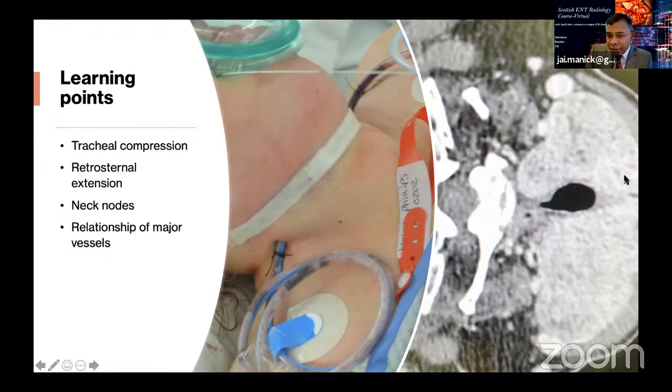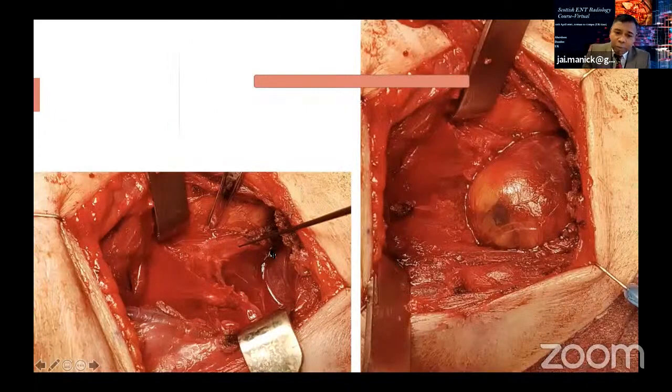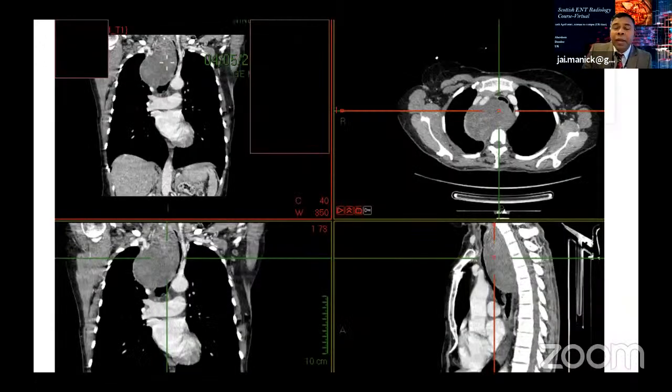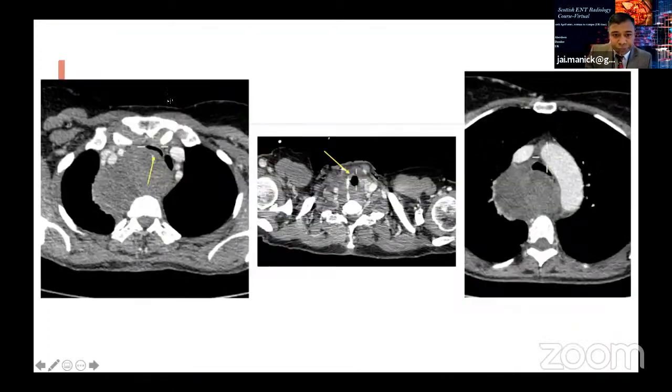And this is a large tumor or thyroid lump, which is actually trying to squeeze the trachea. Normally the trachea is D-shaped. If you look at this picture, this is an intraoperative thyroidectomy picture, and what you see is the tip of the iceberg. Even on the simple chest X-ray, it clearly shows the large retrosternal extension going into the superior mediastinum. This patient underwent a thoracotomy or sternotomy to remove that large thyroid lump. Even in this one, clearly it's squeezing the trachea all the way down to the superior mediastinum, up to the arch of the aorta. If you look at this scan, there's not much tumor in the neck. Everything is actually in the mediastinum.